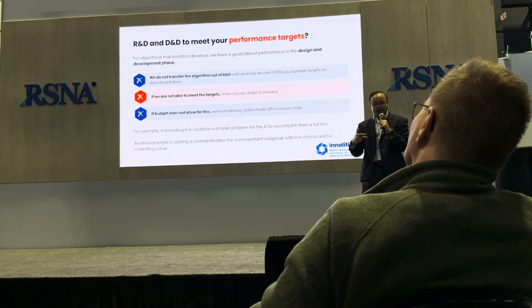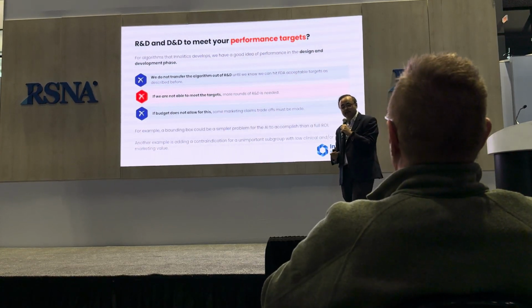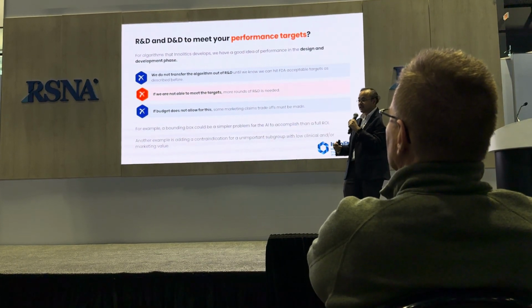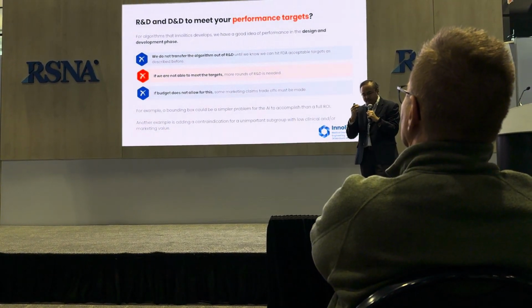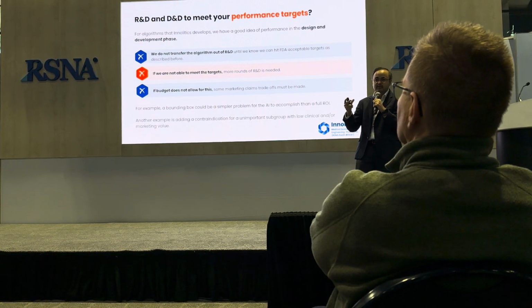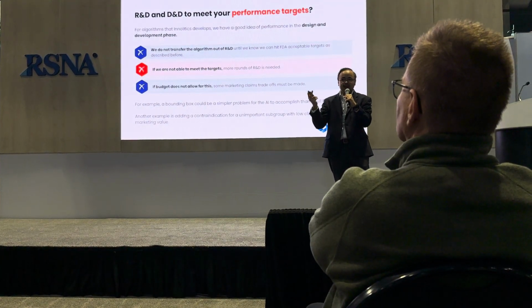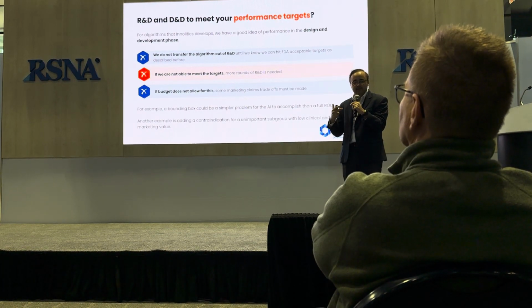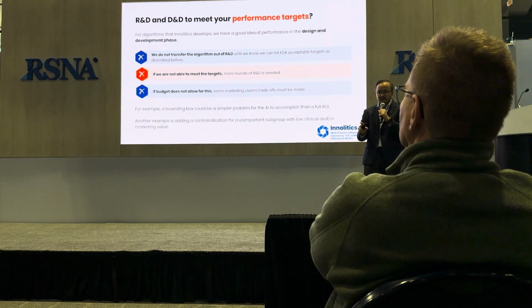Now, unfortunately, not all devices have an unlimited budget or unlimited time frame. At some point you'll get to where there's no more budget for another R&D round, and in this case you'll have to make some trade-offs. Trade-offs might not be as bad as you think. For example, a bounding box to outline the overall location of a tumor could be just as good from a sales and marketing and clinical need standpoint, but it could be 10 times easier from an engineering standpoint. So you can make these little micro trade-offs as you go, to find that sweet spot of creating something that the market wants at a reasonable price point.